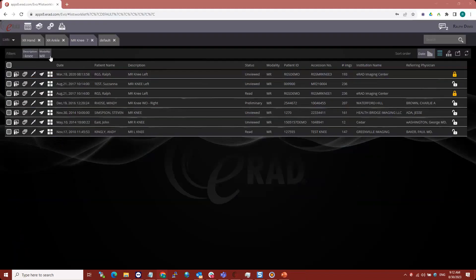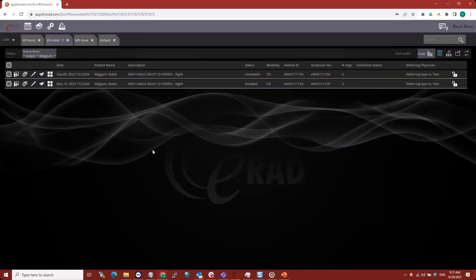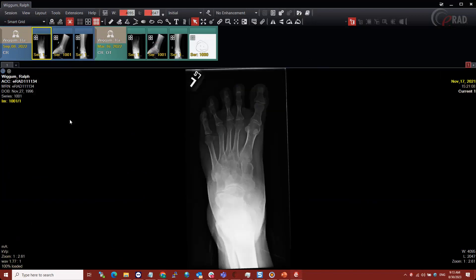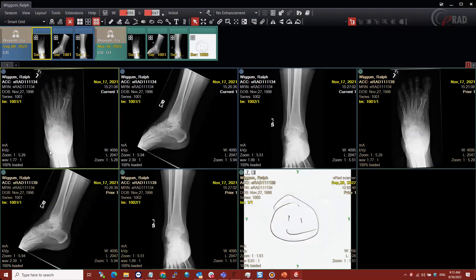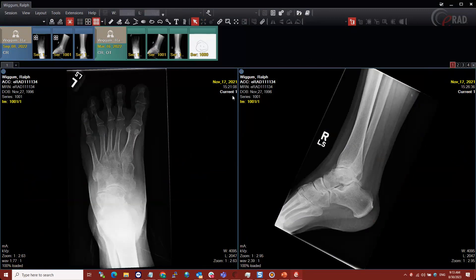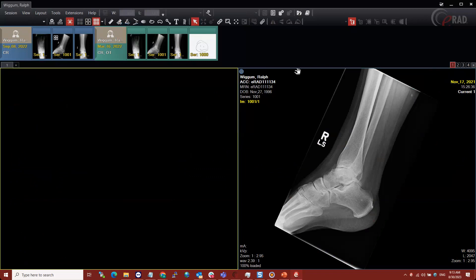Let's look at x-rays. I'm going to open this patient with priors — an x-ray of the ankle. It opened with Smart Grid, which throws everything onto one screen. Some people like this because you can always double-click to maximize an image, but some prefer a 1 on 1 type layout. I'm going to change to a 2 on 1 layout and create a hanging protocol that's a little different. I'll drag these off screen and show how to stack studies by holding Control and double-clicking, which stacks all images in the study into a single stack.